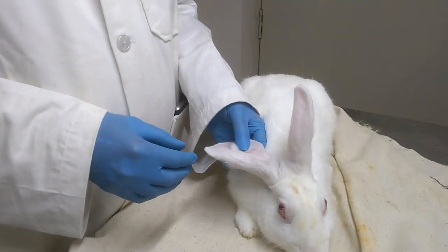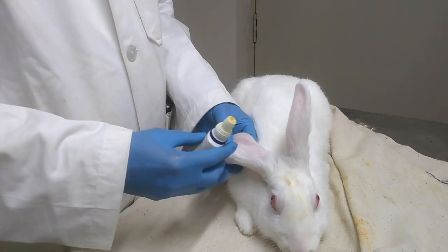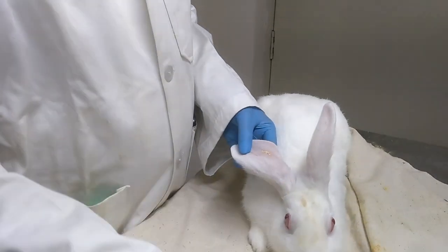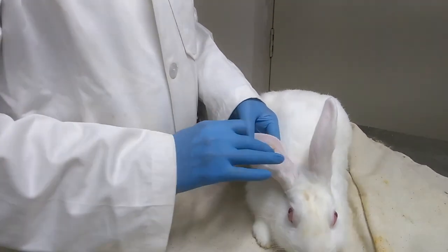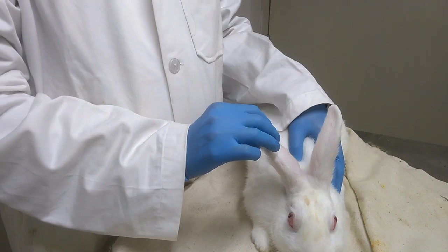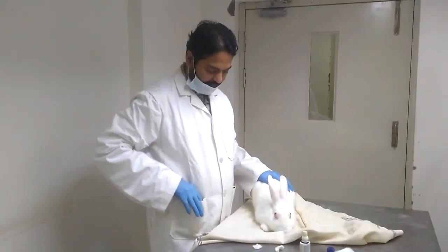So now I think the blood has stopped coming out, and now we apply some antibiotic. Here in this case it is betadine powder, so that there is no further infection or inflammation in the rabbit. This is the ear pinna, and if there is any inflammation it will have some pain, so this avoids that kind of pain also.